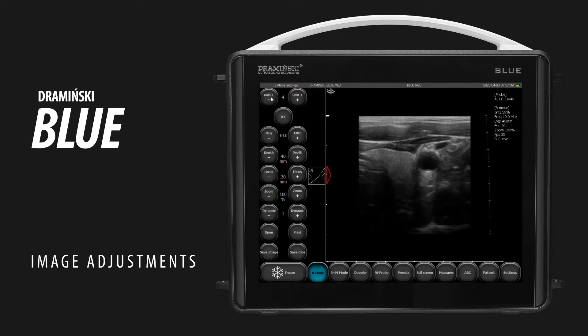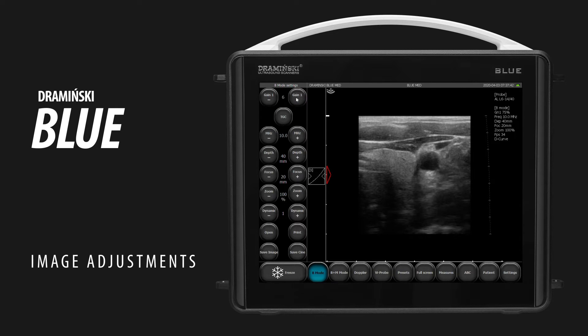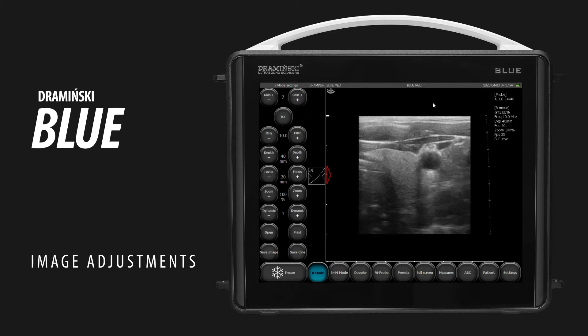To adjust overall gain, use the Gain fields or an active field located at the top of the screen.